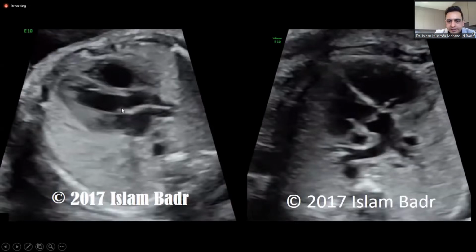This is a normal case. This is an abnormal case. This is a transposition of great artery case. Here you can see the left atrium, the left ventricle, and from the left ventricle, the aorta is coming. This is the aorta. How we can know the aorta is coming all through? No proximal branching. But can you see here in the abnormal case, this is the left ventricle.